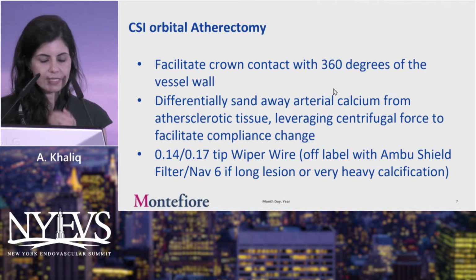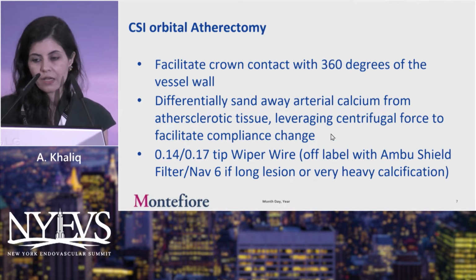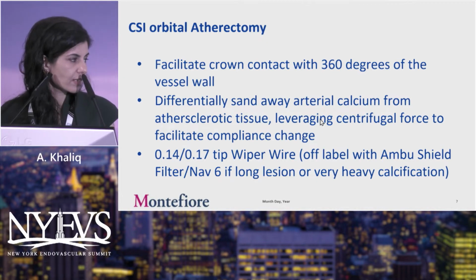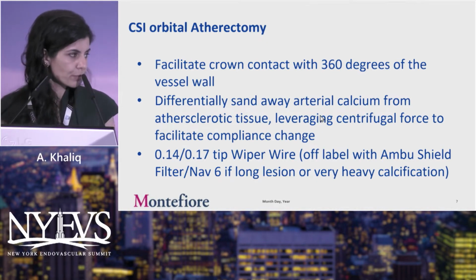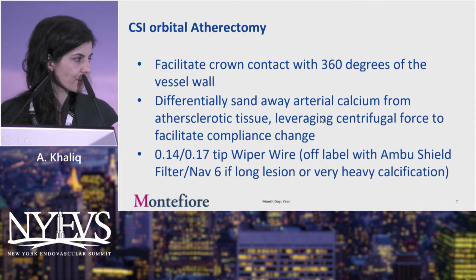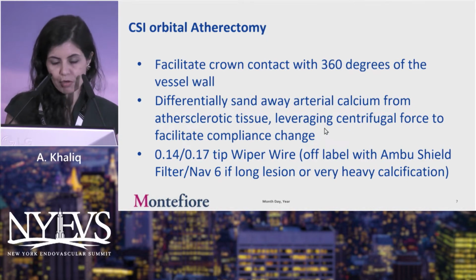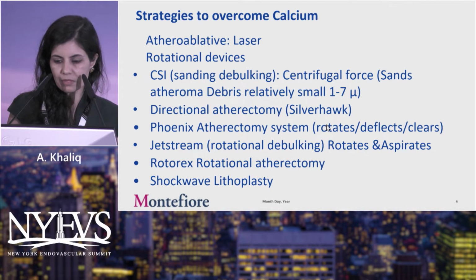Firstly, CSI. As you know from the coronary experience as well, it's the same 360-degree differential sanding away of the calcium, which leverages the centrifugal forces, and that way it facilitates the ablation of calcium. What I personally use for this, which is off-label use, is a Wiper wire.